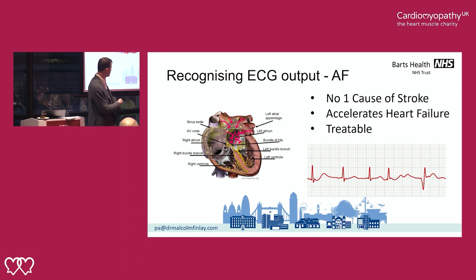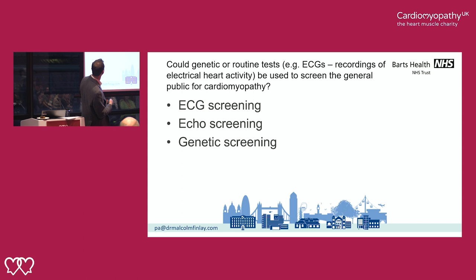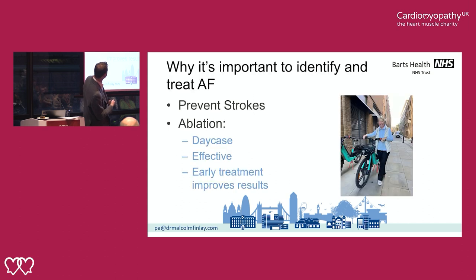And then we look at the tracings of people with atrial fibrillation. Here's one from a patient of mine, where you don't see that clear P wave, and each beat is a different space from the next one. That's because you've got these crazy rhythms firing down that little pathway. These watch traces are good enough to see that, even if it's coming from somewhere else, you can see more curious and interesting things. Atrial fibrillation is treatable, right?